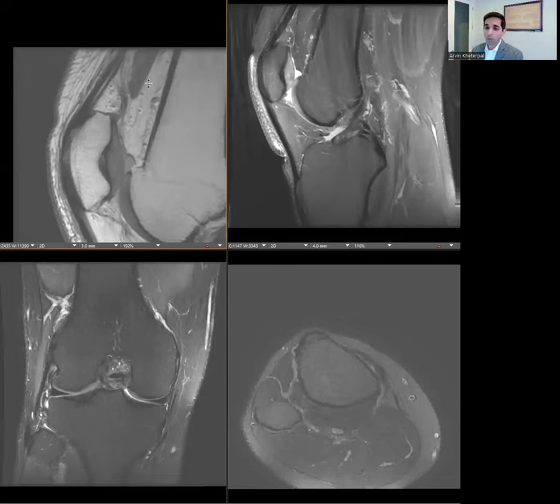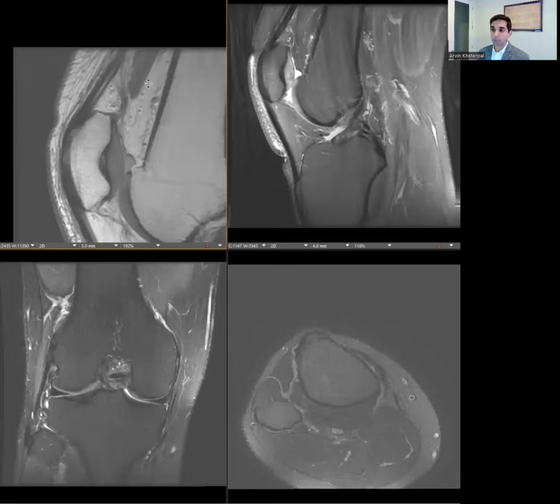Always keep that in the back of your mind when you're looking at a tendon and thinking, could this be tendinopathy or a partial tear? Ask yourself: is this actually a normal layered appearance of the tendon?